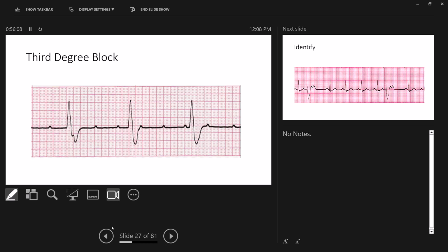And we've got to see it in 2 or more views that are looking at the same part of the heart. Now, none of that will be on your exam, but most definitely, if you were to look at this and tell me that that's ST depression, I'd give you some bonus points, basically because this is your ST segment and it's below the baseline. All right?